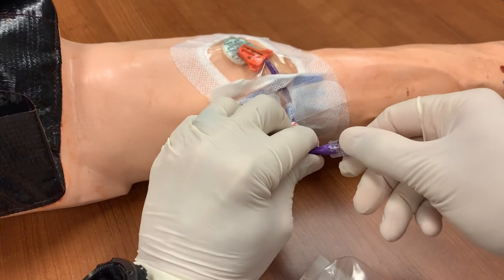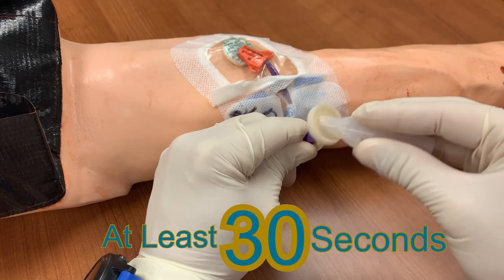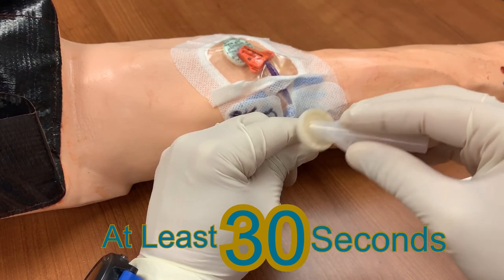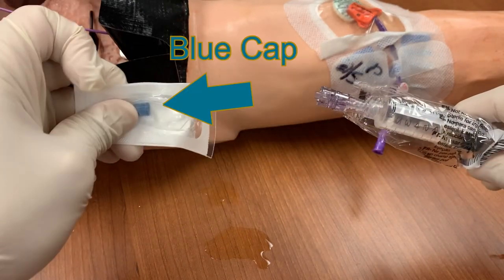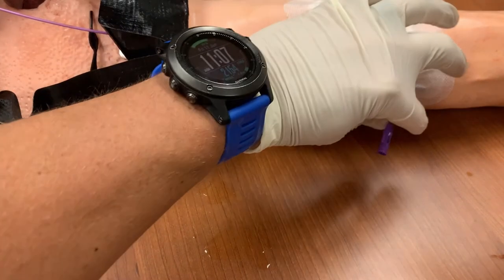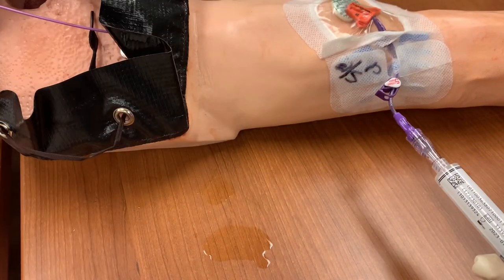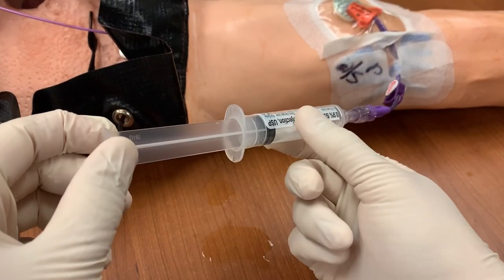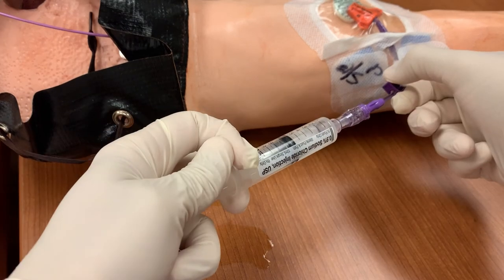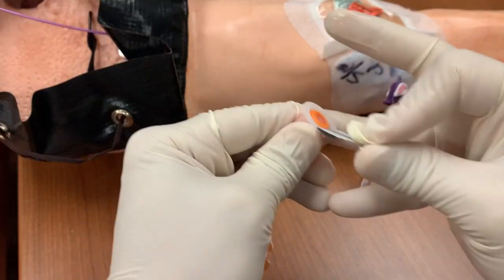Now remove the existing microclave. With your swab, clean the end of the microclave for 30 seconds. Remove the new, primed microclave from the package, and in the process, remove the blue cap from the end of it. Attach the microclave to the end of the catheter. Open the pinch clamp. You should now be able to aspirate a small amount of blood — the mannequin arm is not primed with blood so it doesn't show blood return in this video, but you should be able to get it in an actual human being. Then flush the catheter using the push-pause technique. Close the pinch clamp and apply a swab cap to the end of the catheter.